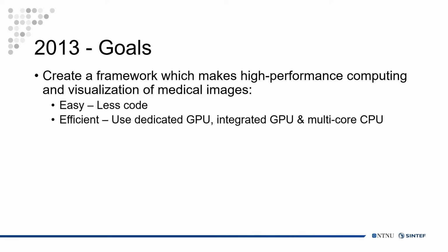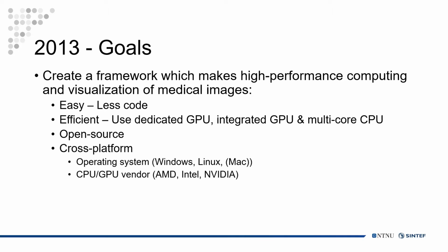Efficient mainly by utilizing a dedicated GPU, but also integrated GPUs and multi-core CPUs. The framework should be open source and cross-platform, both in terms of operating systems, Windows, Linux, and Mac, and processor vendors such as AMD, Intel, and NVIDIA.